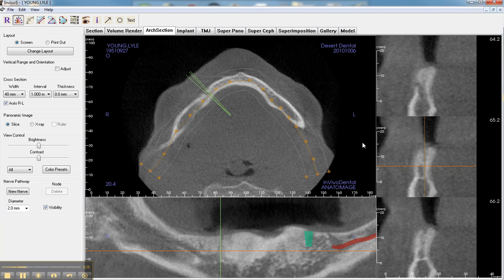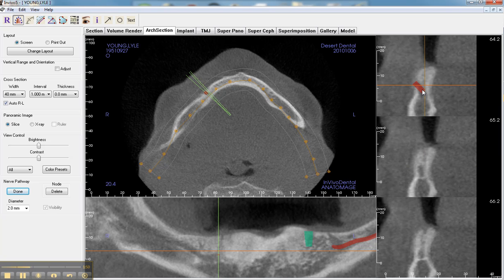To trace the nerve is very easy. You basically move this crosshair to the point of the mental foramen, which I have placed right here. And you can start drawing the nerve as easy as one, two, three, starting out from the cross-sectional view and continuing with the panoramic view of the inferior alveolar canal. By double-clicking, you've defined the nerve.